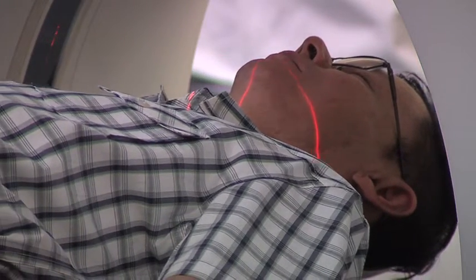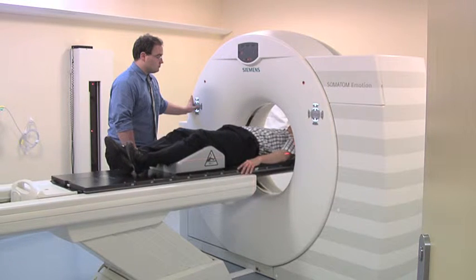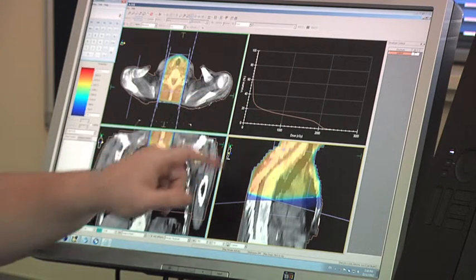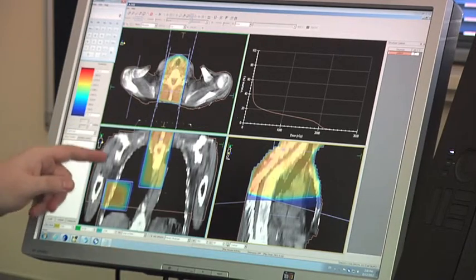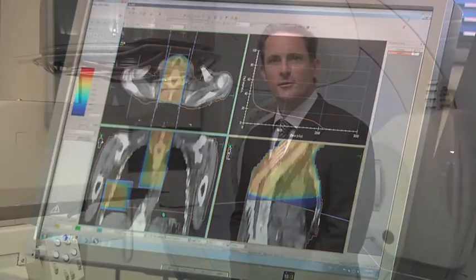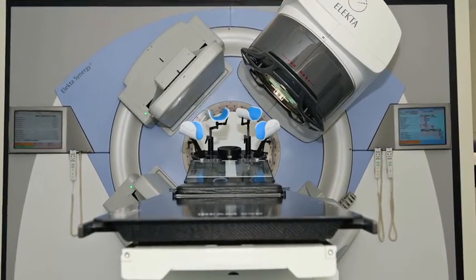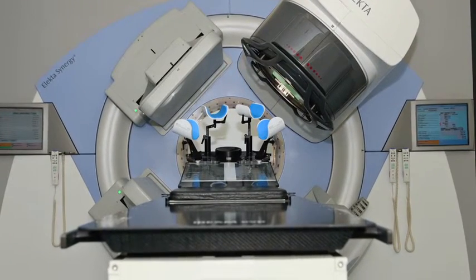This will take around 45 minutes and be conducted by a team of radiation therapists. During simulation, detailed imaging scans are required to show the location of a patient's tumour and the normal areas around it. Essential to high-quality radiation therapy is ensuring that the patient will be in exactly the same position every day relative to the machine delivering the treatment. Special positioning equipment such as head and neck masks and boards could be used for individual patients to make it easier for a patient to stay still.